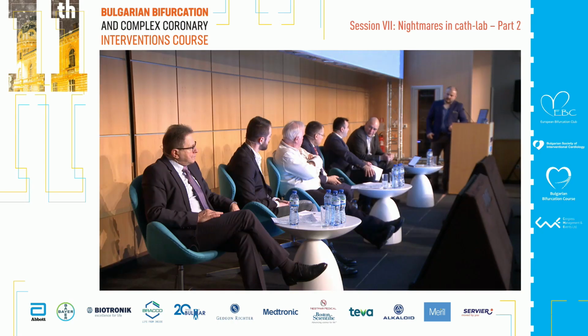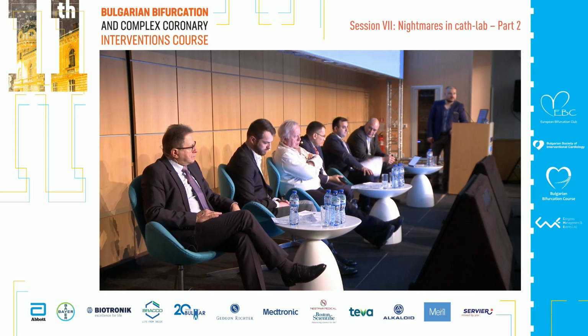Yes, it happens, and I have several cases of chasing stents in the coronary vessels. I remember one case which we presented 12 years ago in Switzerland, I think, with Alexander. It was a very interesting case which we presented at the Euro PCR course in Lausanne, when we were chasing a stent in the coronary arteries.